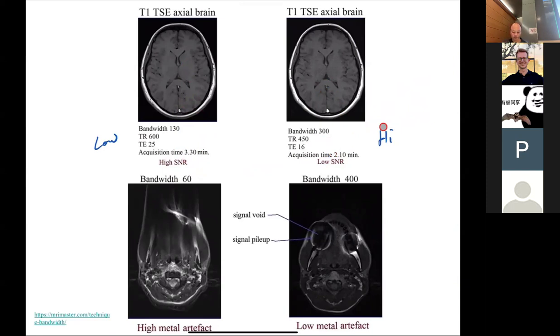Another case is, remember with low bandwidth, it takes longer to go through K-space. So there's more time for the spins to just do whatever they want. For example, we saw in fMRI, the longer you wait, the spins have more time to dephase. Essentially, anything that's not ideal will make the spins get out of phase and mess up your ideal imaging.